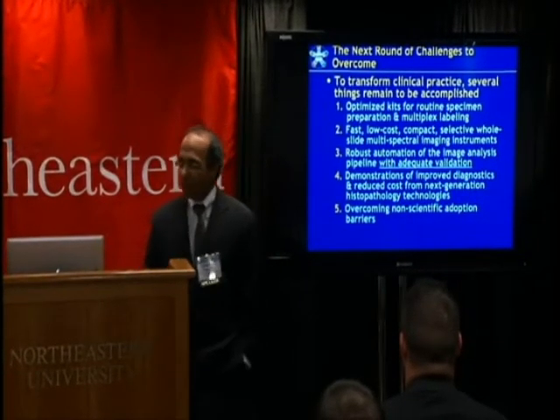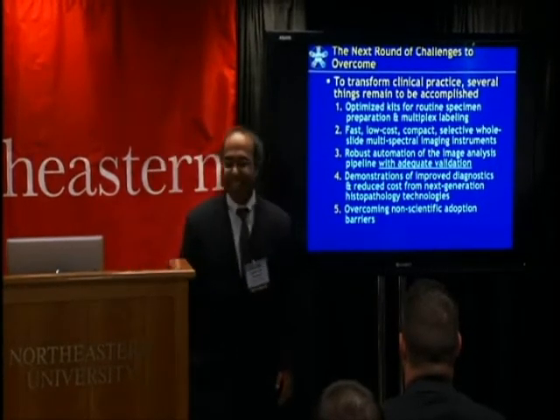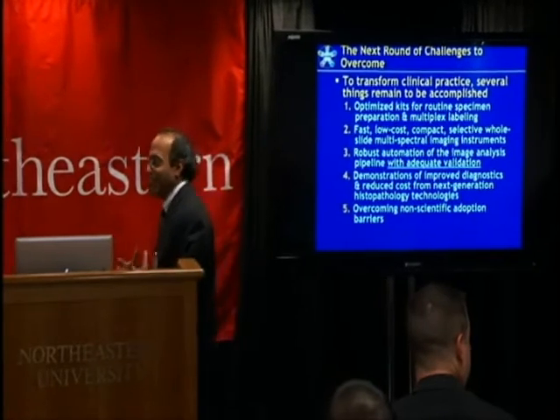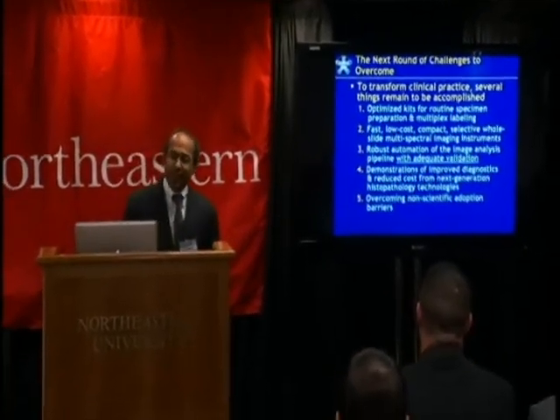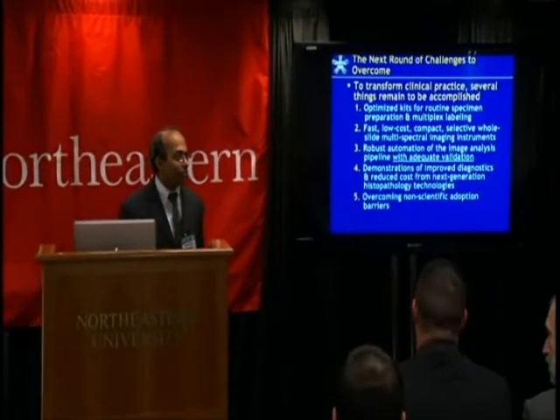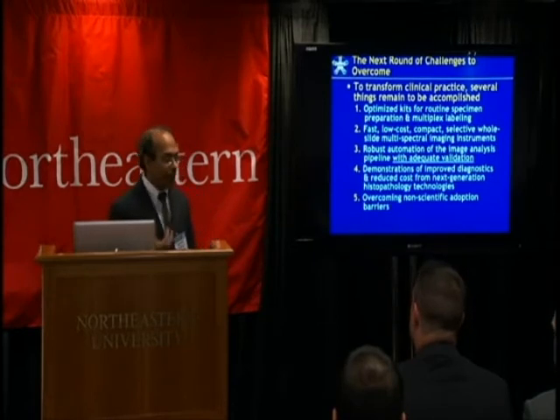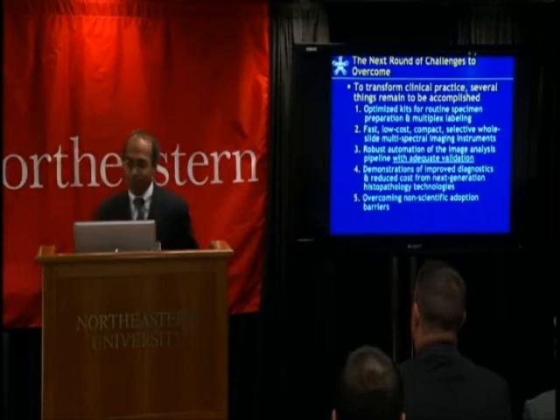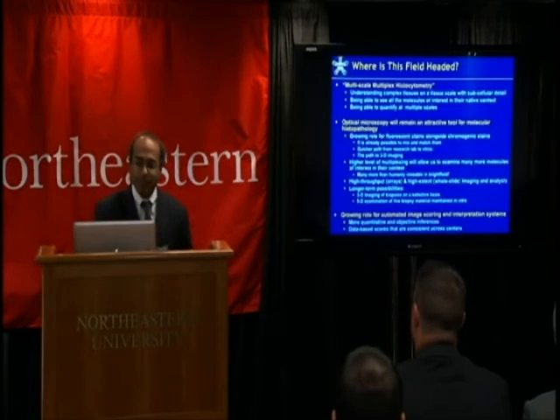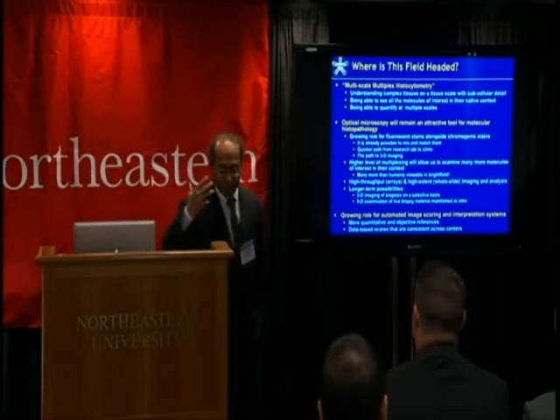We still have a long way to go. I think that this is where realists like Mel can get into the act, and companies can build systems, labeling kits, faster microscopes that can scan the entire slide, integrate that with the software, put them on faster GPUs and servers and so on, right? And of course, companies can also be out there in the field and help overcome some of the non-scientific adoption barriers that we face.